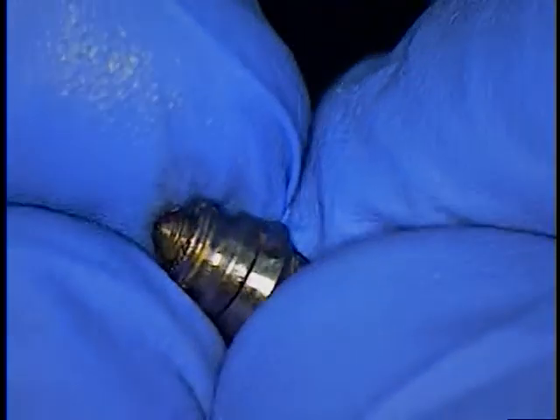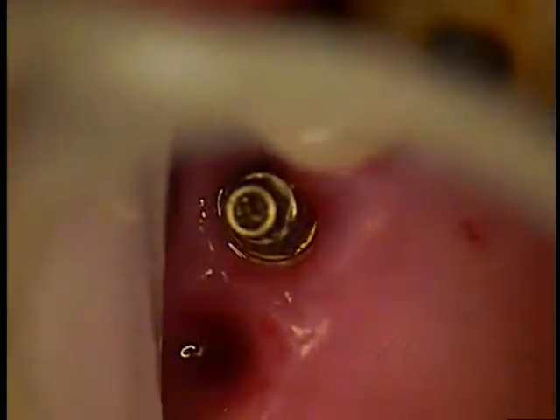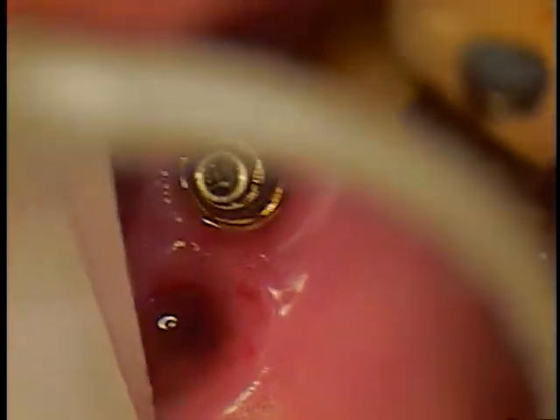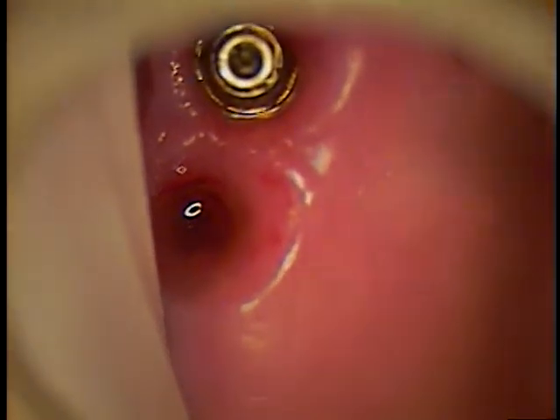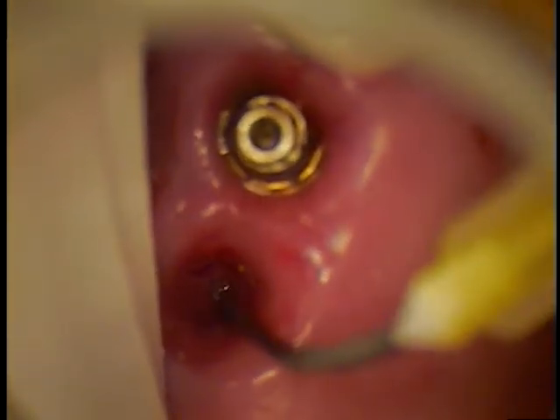Okay. All right. Well, better to know. That's 14. Okay. Let's look in the mouth and see if there's anything else. I'll use the microsuction now. Yellow tip's fine. Okay. Well, it's the distal one, and if it had to happen to one, that's the one. Yeah, there's no other component here, so that's fractured.